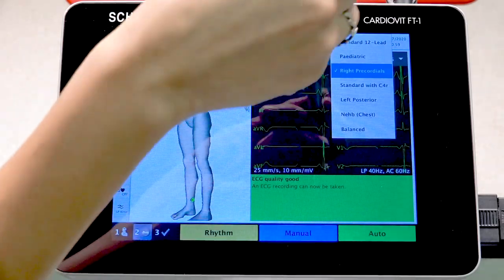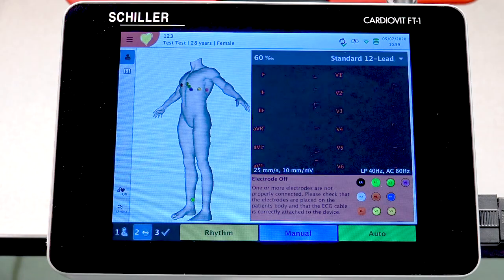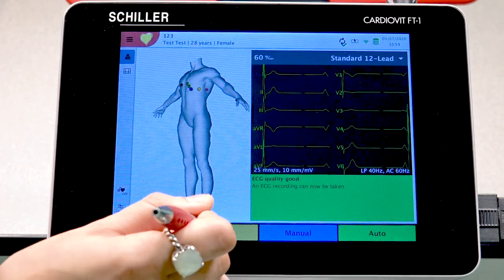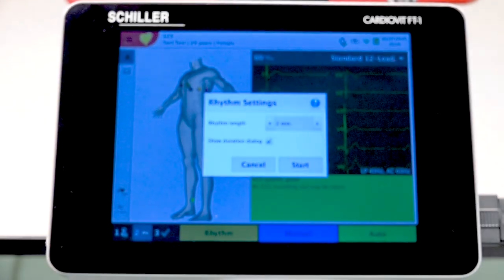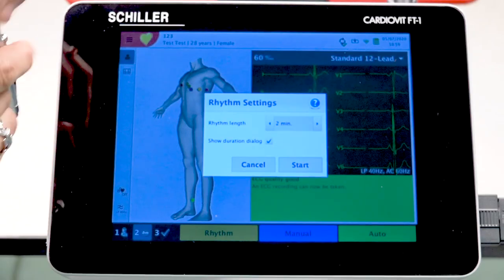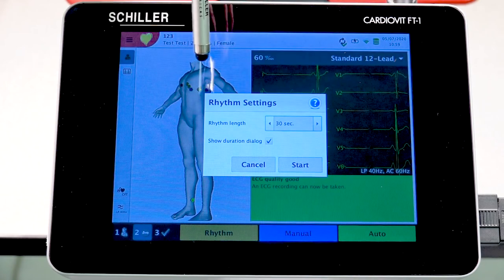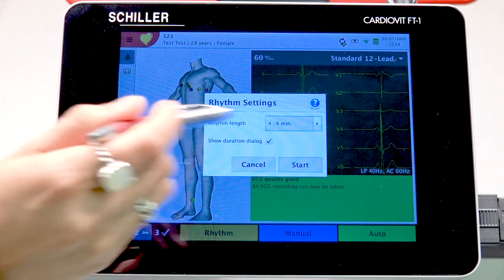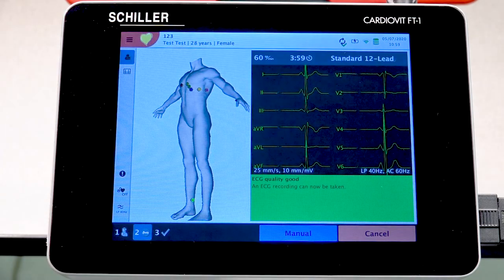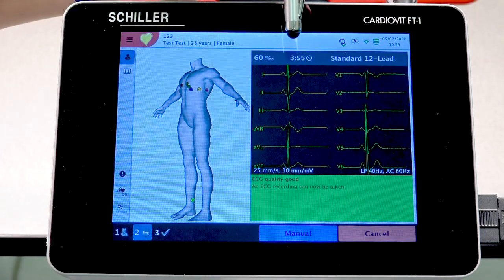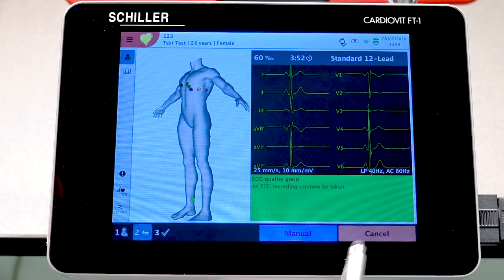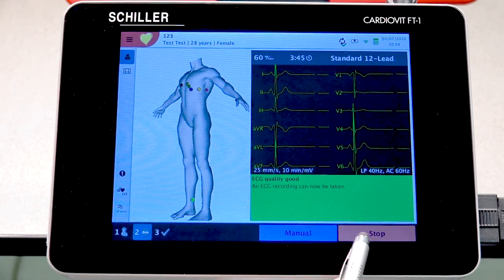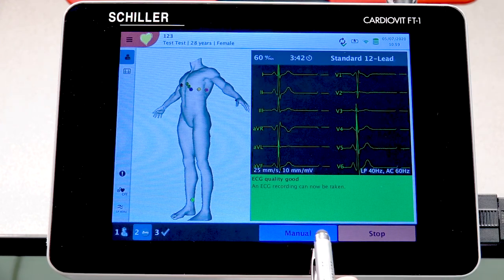Instead of performing the auto ECG, we're going to select Rhythm. When you select rhythm, you have the option of performing a minimum of 30 seconds or a maximum of four minutes. Let's select four minutes and press Start. You'll see a countdown clock. For the first 10 seconds, you can only press Cancel. After the 10-second mark, you can press Stop. Anything recorded before 10 seconds will not be saved.